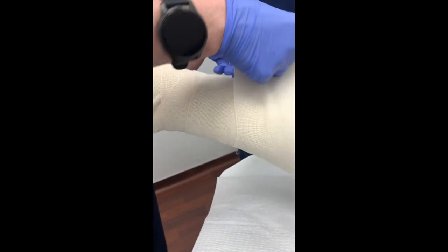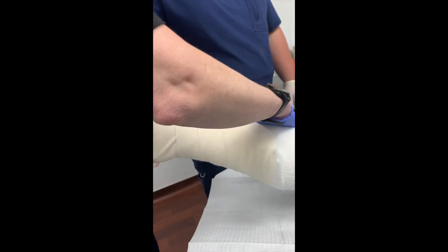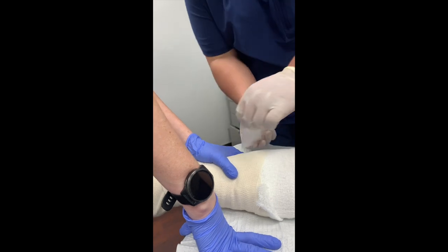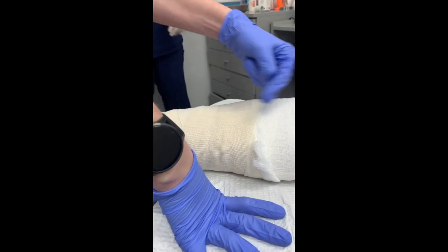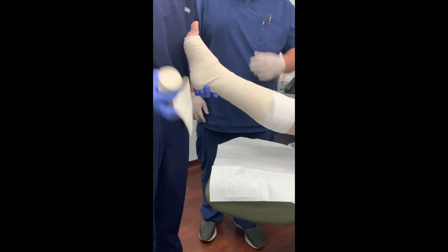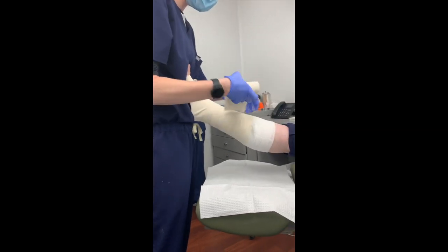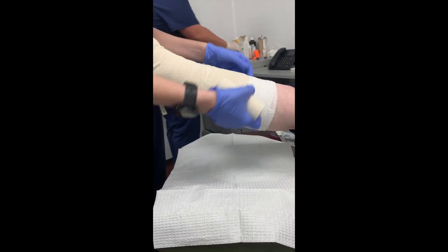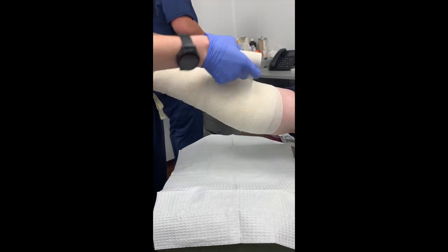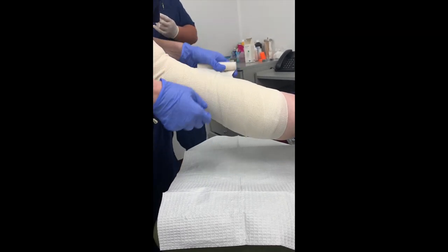If you have a patient with a pretty large leg or really large, long tibias — like an NFL player — you might need two ace bandages. You can see ours fell a little short, and I want that compression up higher, so I'm going to use a second ace bandage. Typically you'll use about two if you're going from the foot to the knee. If you don't have an assistant, you can use your core to balance the patient, make sure they're comfortable, and start right where you left off.